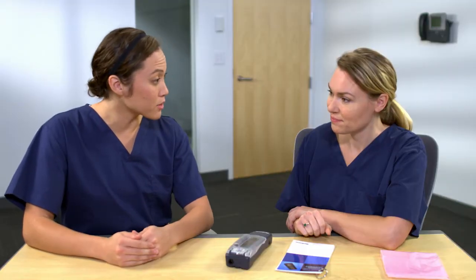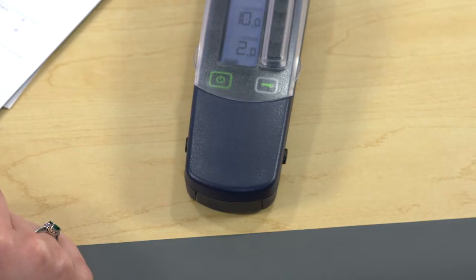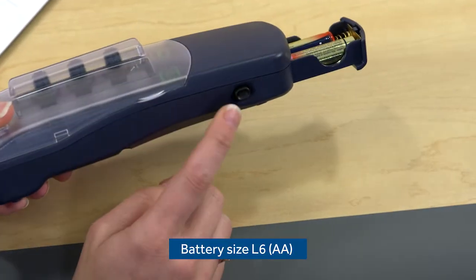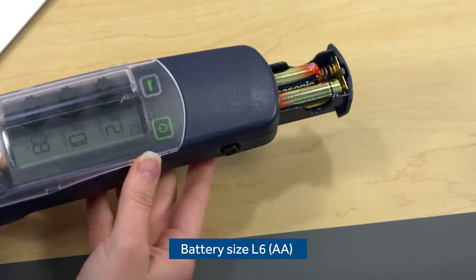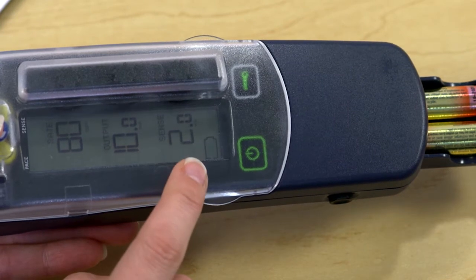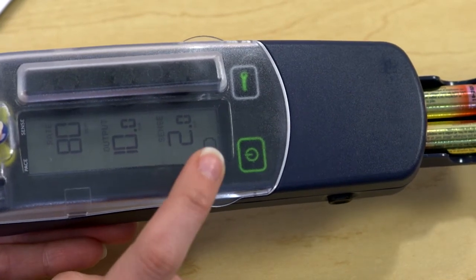Where do I install the batteries? Great question. To release the battery compartment, just press these two buttons. Those are AA batteries — is it okay to use lithium or rechargeable batteries? No, only alkaline. There's a 24-hour low battery warning, which only applies to alkaline batteries.